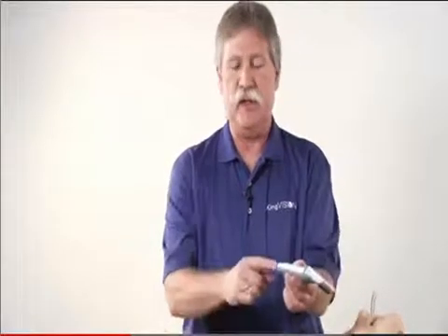It's important to note that because of the electrical connection on the bottom of the display, it is not fully submersible. So in cleaning and disinfecting, make sure that you don't get any liquid into that electrical connection. And in fact, it's best to hold it upright so that as you're applying any solutions, it really has no way of getting in there. We would suggest you use a 4x4 or some sort of wipe that's moistened with either the cleaning or disinfecting solution that we would recommend to just wipe down the device so that you can avoid submersion.